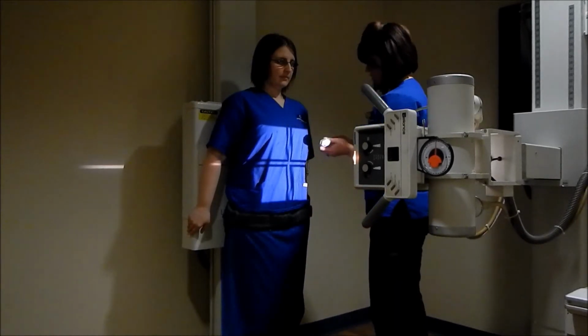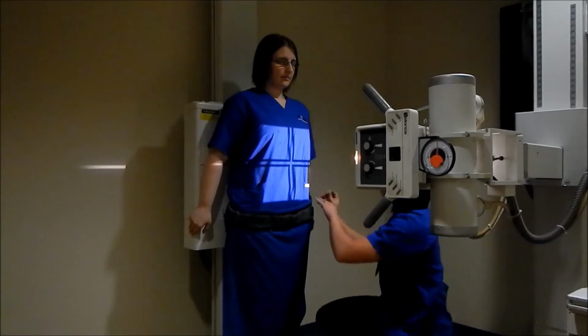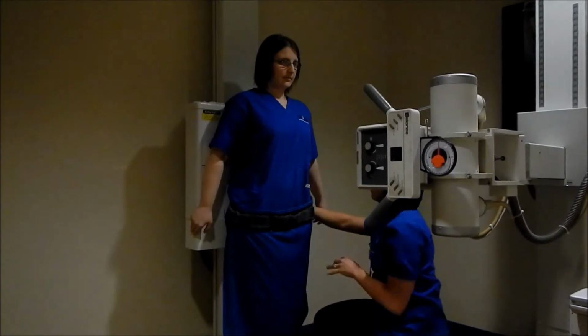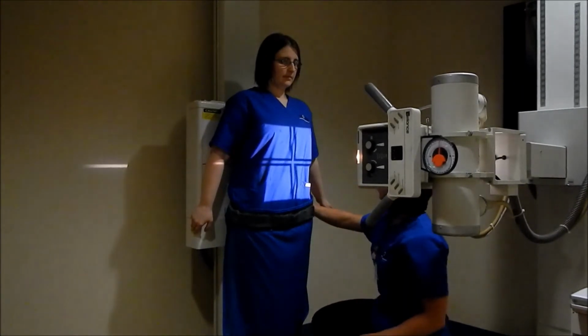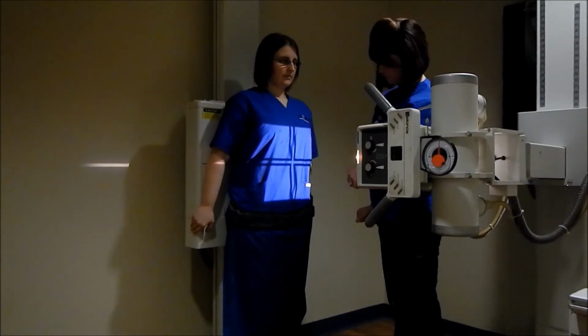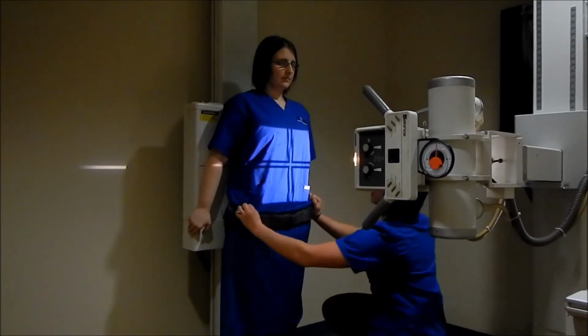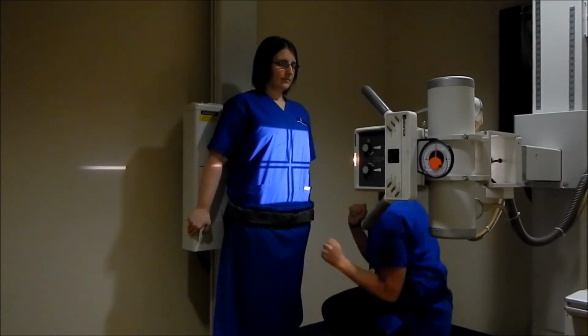She looks good there. You're going to want to put a marker. I'm going to use the left this time. Put it on her left side and make sure you've got it in the light but out of the area of interest. That looks pretty good. This is out of the way.